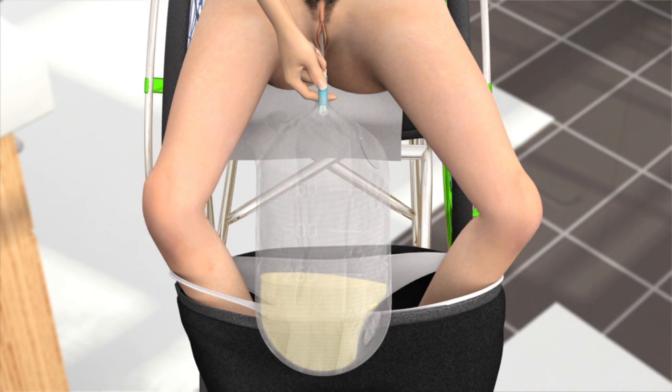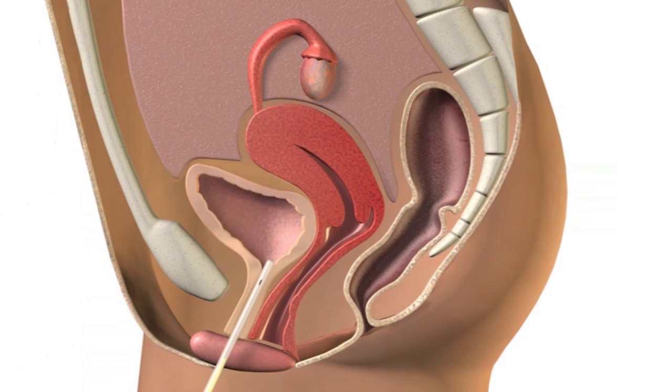Then insert the catheter about one inch further and hold it there until the urine stops. When the flow stops, move a little and straighten yourself up to make sure that the bladder is completely empty. Withdraw the catheter slowly to ensure that you drain any remaining urine at the base of your bladder.